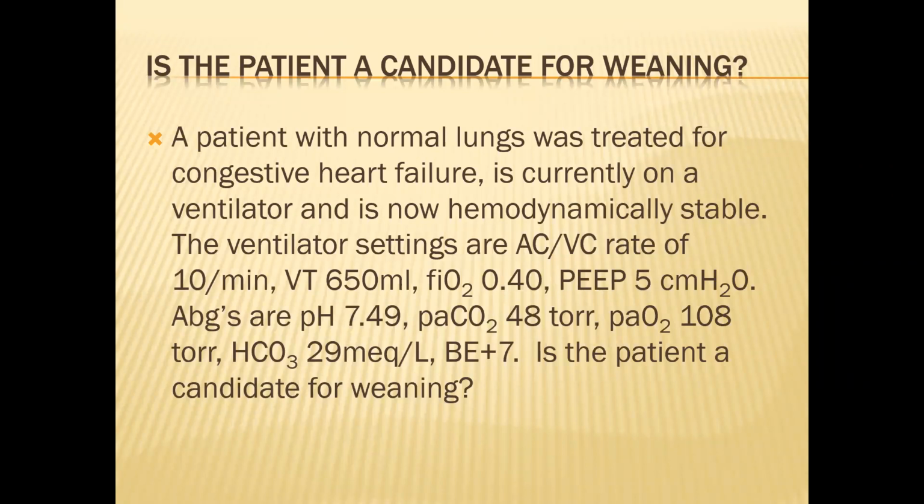So what do you notice about that pH? It's pretty alkalotic. What's causing the alkalosis? The bicarb, right?